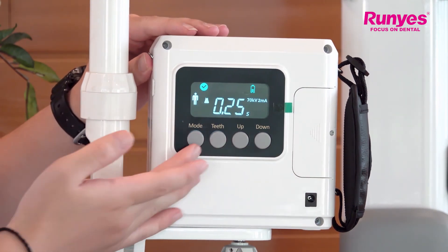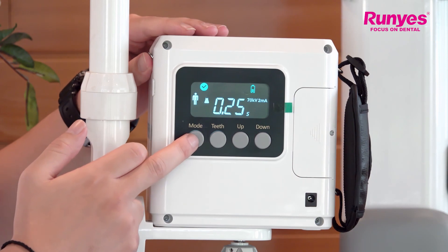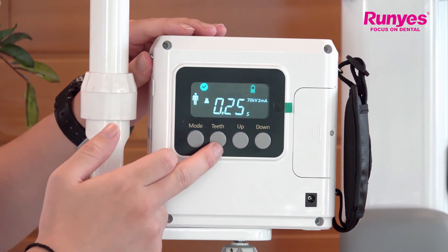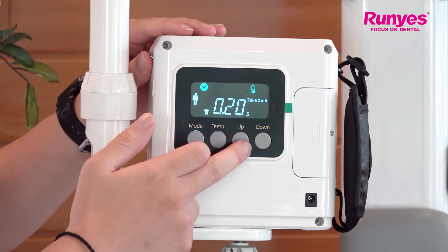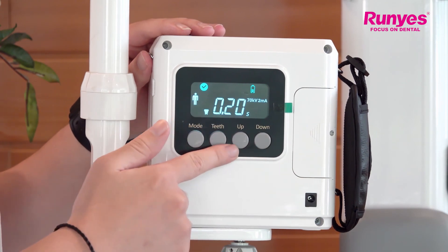First let's take a look at these four function keys. The first is the mode key — you can select the adult or the kid mode. And here is the tooth selection — you can select the tooth you want to shoot. And here the up and down keys, which means you can increase or reduce the exposure time.